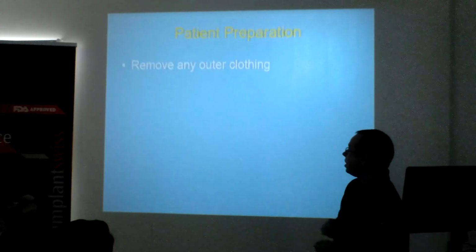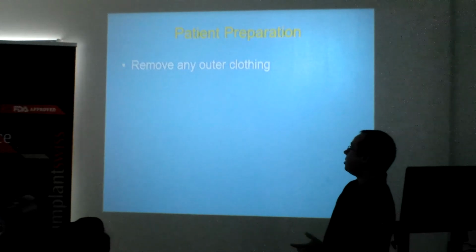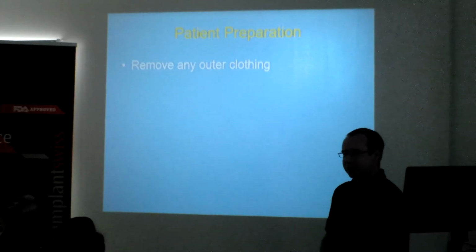So, patient preparation is absolutely vital for cone beam CT. The first thing we always say to the patient, especially in winter, is to remove any outer clothing. So coats, scarves, hats. What happens when we get the patient in the room?